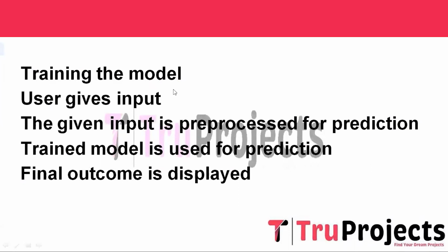The deep learning models, including these algorithms, are trained on the training dataset. The model learns from the labeled images to recognize and classify them. And the next step is the user gives the input. A user-friendly web interface is developed using Flask, allowing the user to input the medical image for the osteoarthritis prediction.